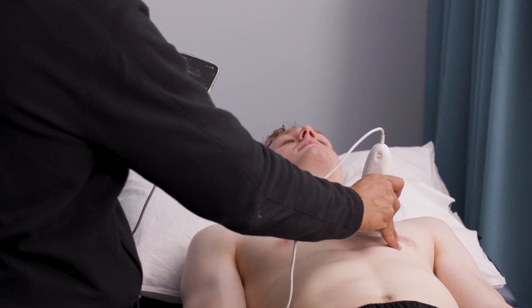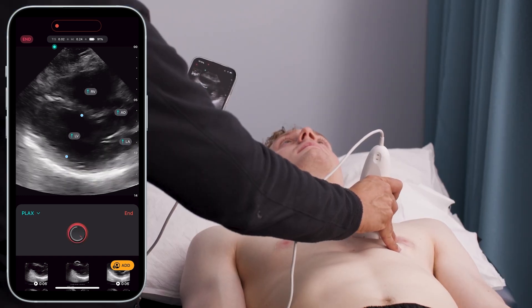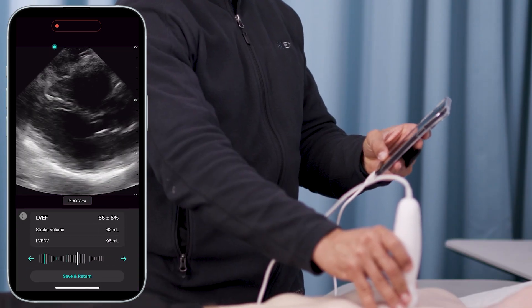Right away, when I turn on the AI in PLAX view, it begins analyzing the image. Once I have a good view, I click a button and the AI calculates left ventricular ejection fraction and stroke volume. It also allows me to scroll back and forth to review my imaging. Really fantastic.